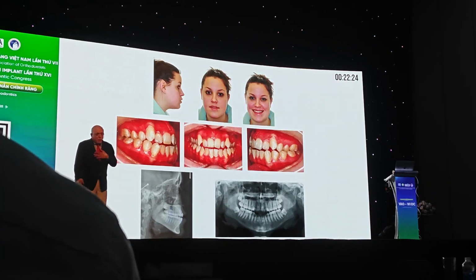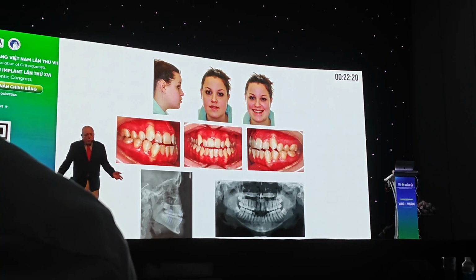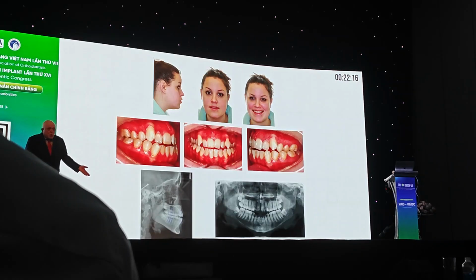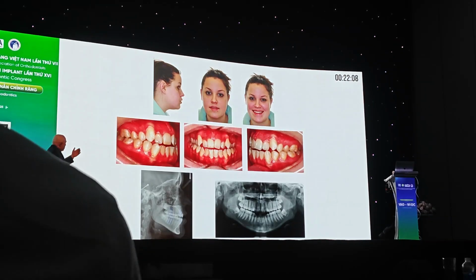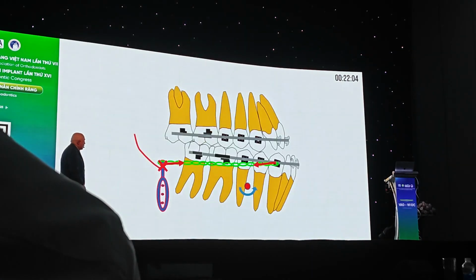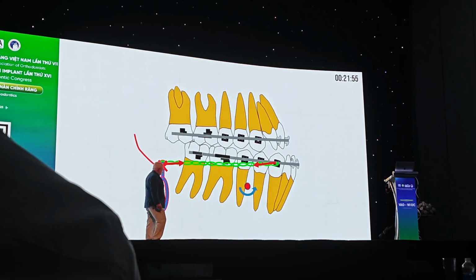But most of the TADs when I was in Connecticut, we used Forestadent TADs. Because I worked with Forestadent very closely. Now they have come up with a newer system. More TADs. Take a look at this patient. It was done in the department. We didn't want to do surgery, nor did she want surgery. So we said, okay, let's retract the whole lower arch. This patient was done a long time back, and you are using a Sugawara system here.